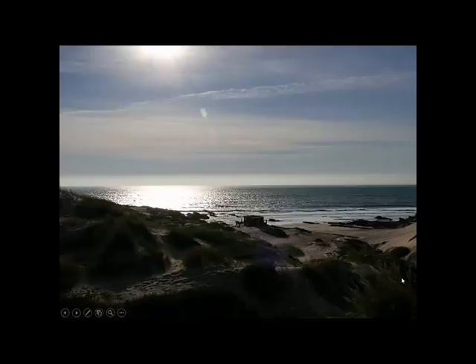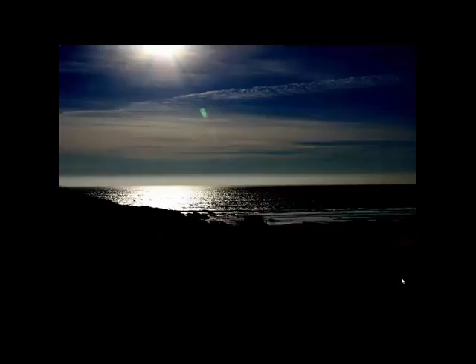If I would now window only with a linear operation into the white area without image processing, this would happen. We can now see the brighter area of the image much better. We see that we cannot recover this area because this area is now completely white, clipped by detector clipping, like the sun. But the rest of this bright part in the image is very nicely visible. But the price that we pay is that everything else is completely black.